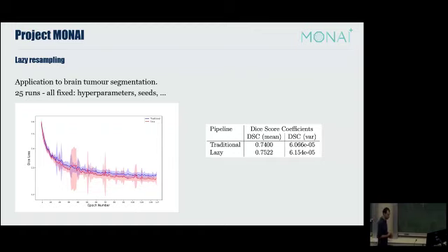operation. But the important part is not really the time, because it's not going to be a fast process in our domain. Whether it takes 2 days or 2 days and a half is not going to change the world here. I'm still nowhere near real time. But we've got better results, and we've got results that are more stable. So that's how we are contributing to MONAI. We are using it, but also contributing to some of these Lego bricks so that everyone else can use them.